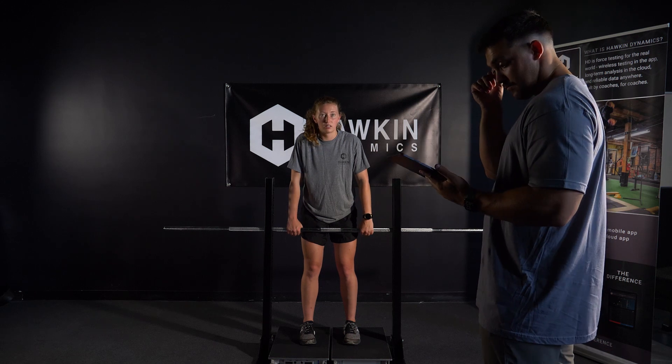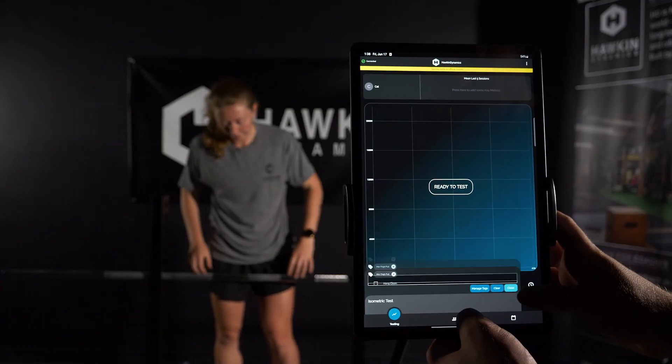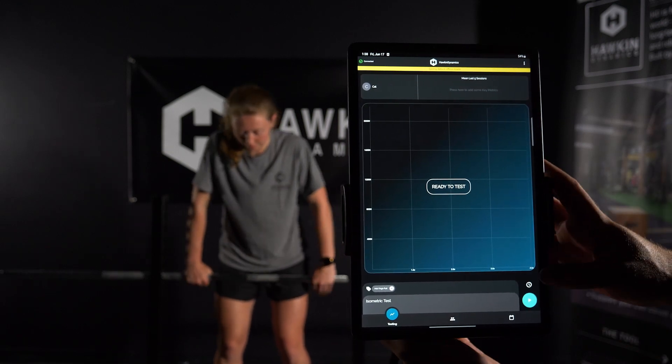Once the athlete is in position, cue to remove slack out of the bar without pre-tensing the involved muscles. The athlete should remain still and in position until the test begins.